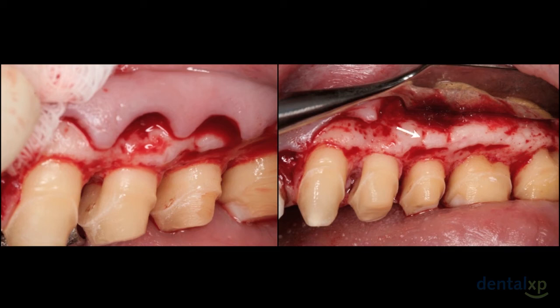The arrow points to the exostosis, which are considerably significant in this case, and again run 3 to 5 millimeters in a buccal direction. The next arrow shows you the periosteum present. So in this case, I did a full thickness flap followed by a split thickness flap.